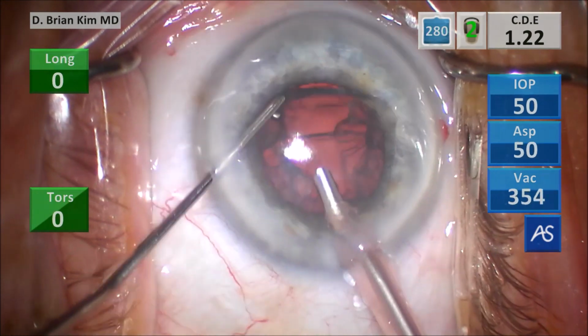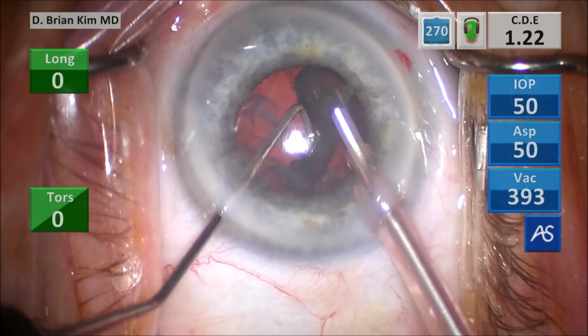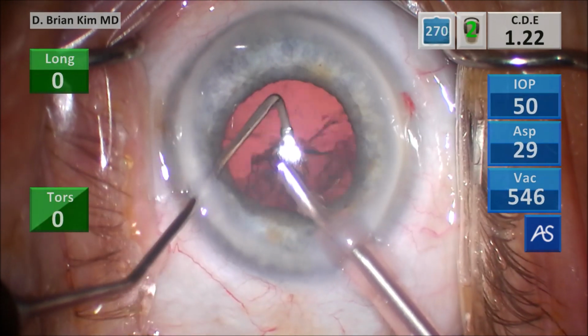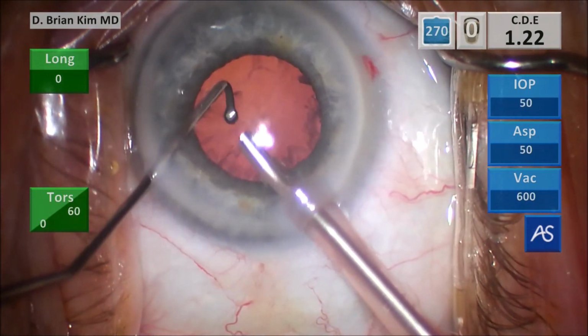loosening it up, hooking it up with the chopper, loosening it some more, and then grabbing it again with the vacuum, and it tumbles out nicely there. Make sure I keep the chopper deep in the bag to protect the posterior capsule.